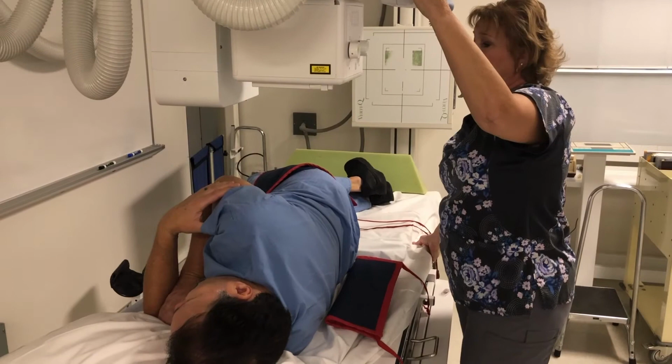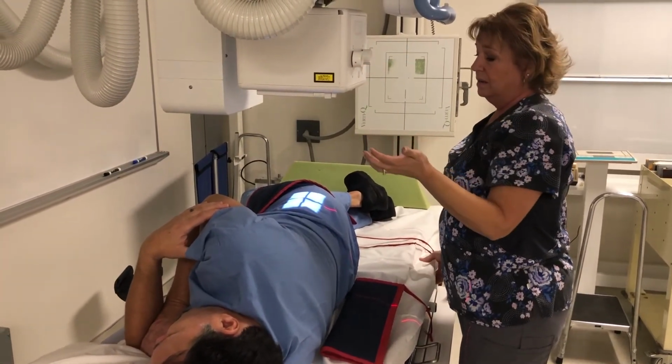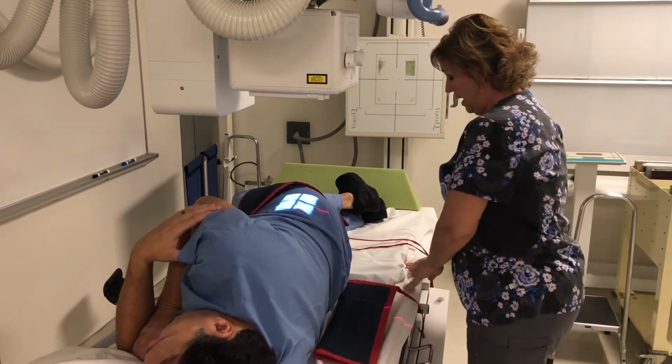Now you're also going to hear a lot of different positioning techniques to get the L5 S1.